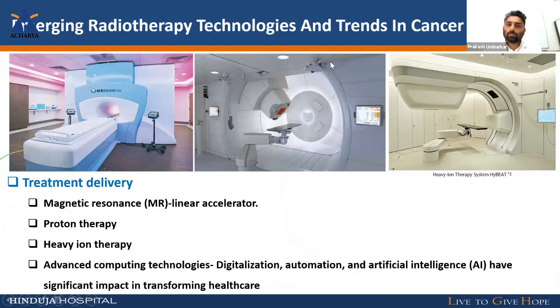Proton therapy has many advantages in treatment modality and treatment delivery pattern, and carbon ion therapy is just in trial abroad. We do not use it nowadays in clinical practice in India, but this is an upcoming trend in the future. Maybe some centers will also buy this technology.